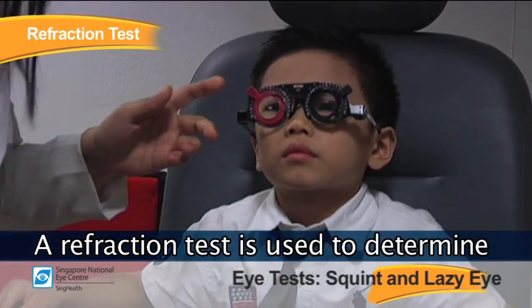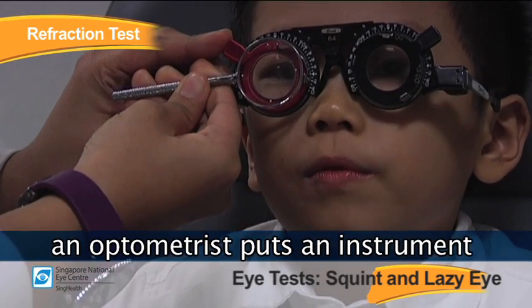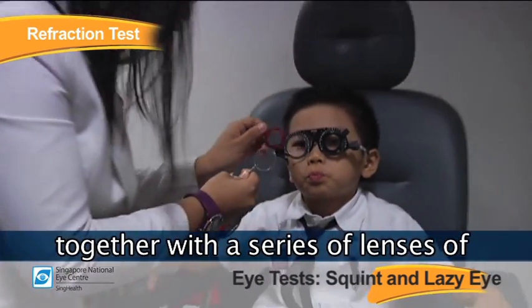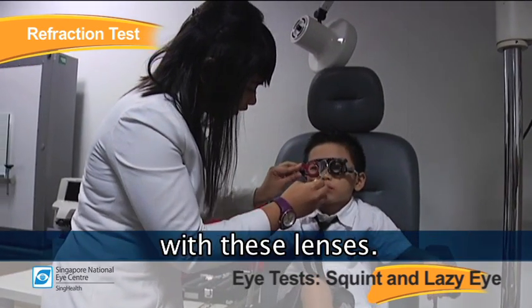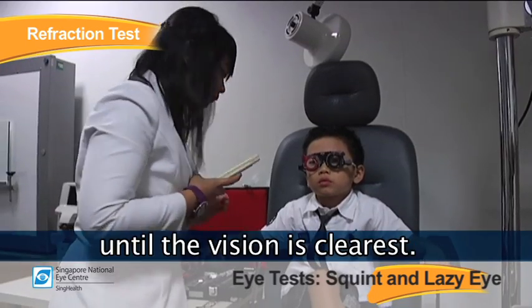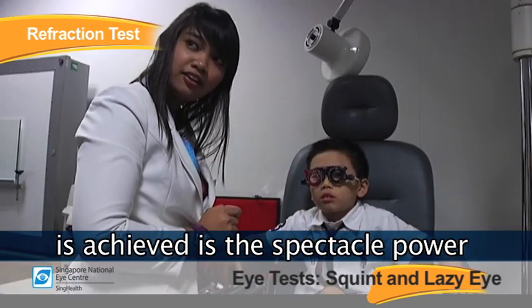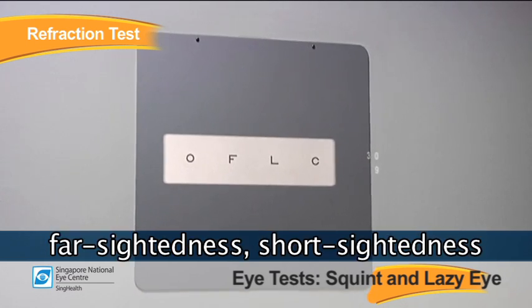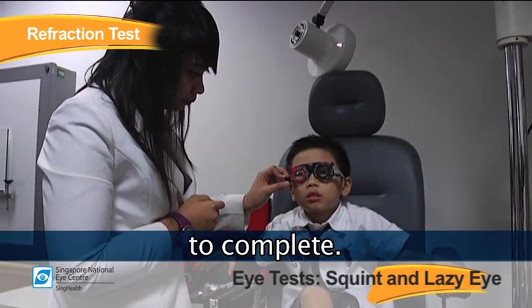A refraction test is used to determine the spherical power of the eye. During refraction, an optometrist places an instrument called a trial frame in front of the patient's eyes, together with a series of lenses of various powers. The patient's vision is then tested with these lenses, and the optometrist continues to fine-tune the lens power until the vision is clearest. The lens power at which the clearest vision is achieved determines the spectacle power of the eye. Refraction determines the degree of far-sightedness, short-sightedness, and astigmatism. The test takes about 10 to 20 minutes to complete.